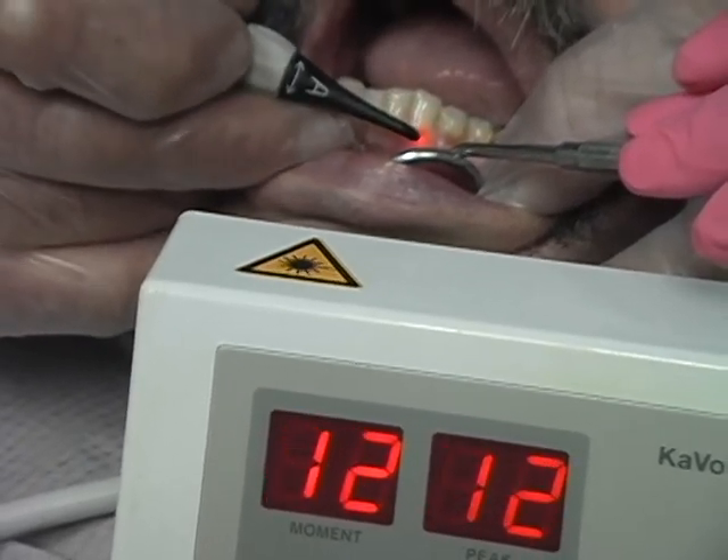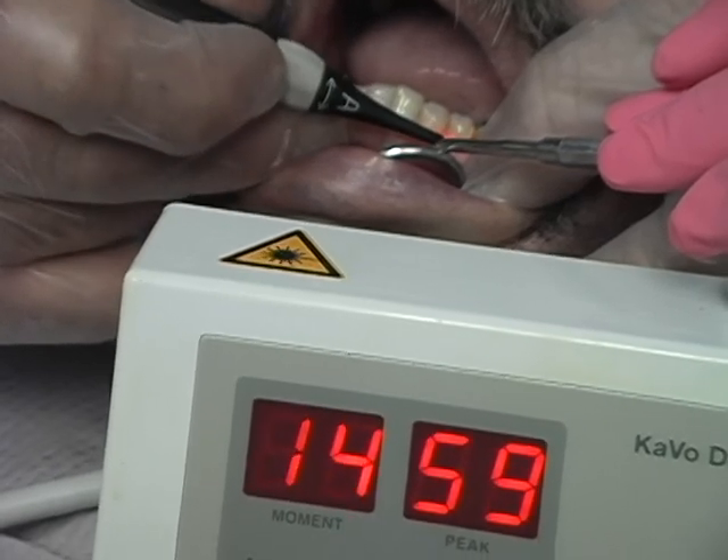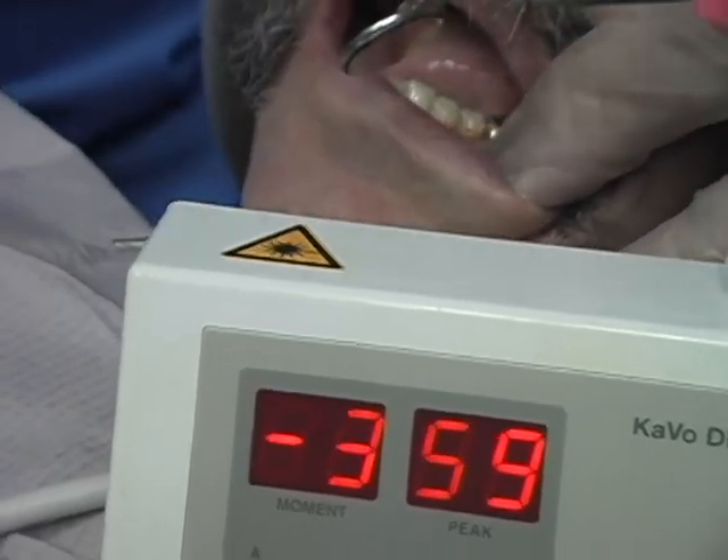We're going to show you how we use the Diagnodent for decay removal. As you see here, we have three teeth that have some severe cervical decay.